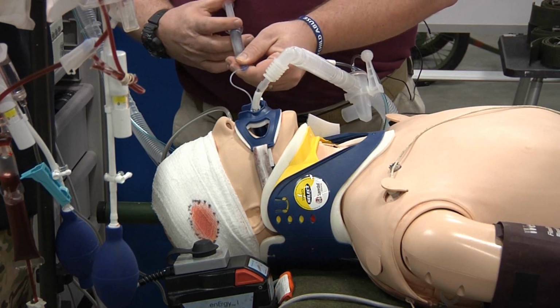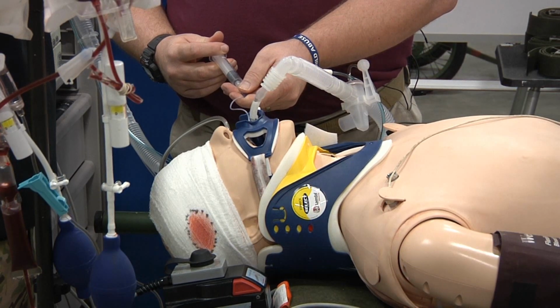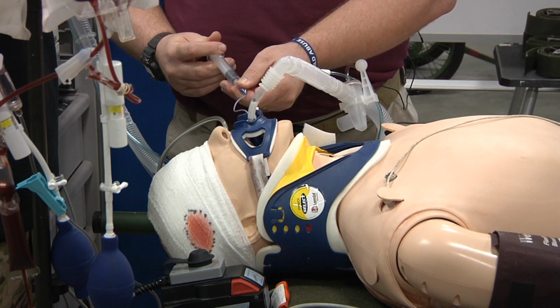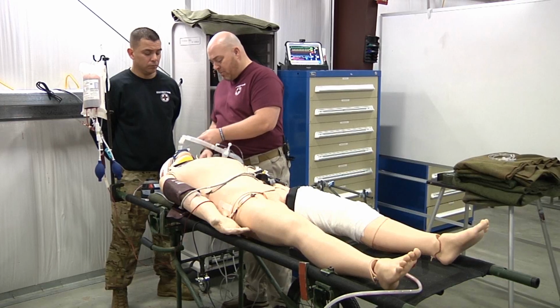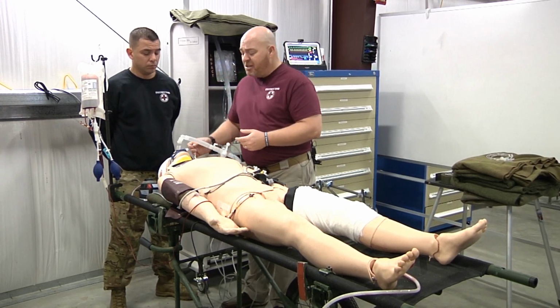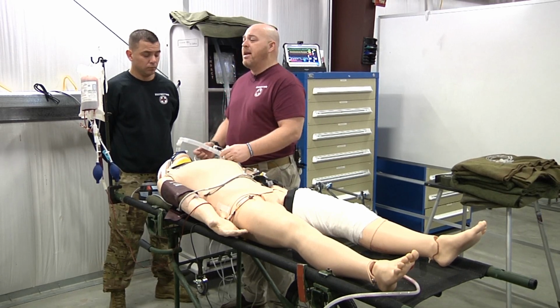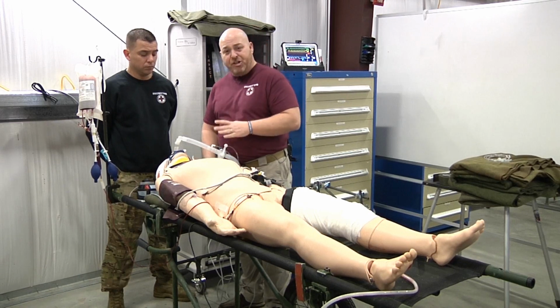And then what you're going to do is you're just going to slowly inflate air back into the cuff until your low pressure alarm goes away, ensuring that you have just enough air in there to maintain a positive seal in that airway. Sometimes these ET tube cuffs can be overinflated, and as you climb up in altitude, that can cause problems for you in flight. This is just a good technique.